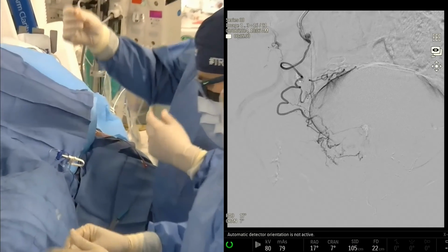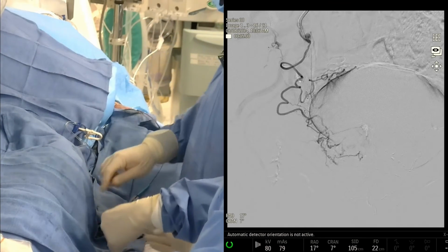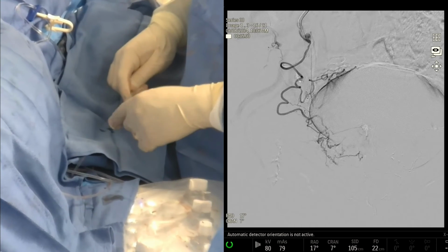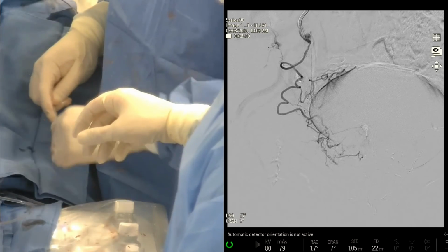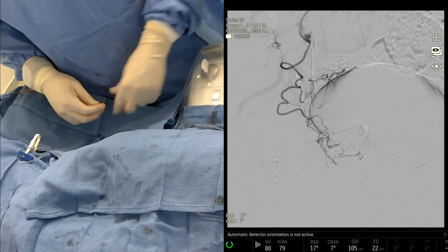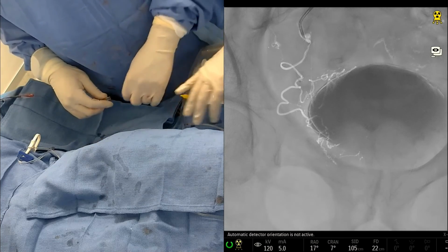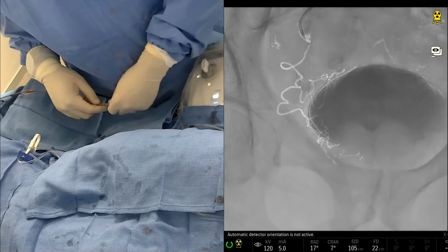At what point are you trying to go after those branches? I mean, like you said, if it's coming off of the rectal, it may not be feasible. It's not that we couldn't do it. It's just, the risk is that we get a fair amount of non-target rectal ischemia if we really get distal into that spot. And so I'm going to say today no, but if he doesn't get the best response in the world, we could consider it. But I think given that we see the majority of the prostate hopefully being treated after this injection, we'll probably just see how he does, and we'd have to bring him back to do that. In my experience, that's not going to be a significant contributor to his symptoms.